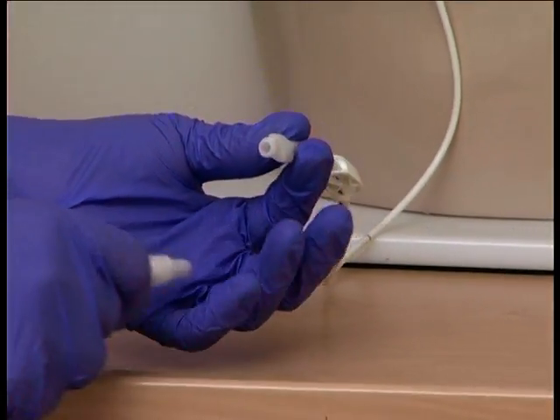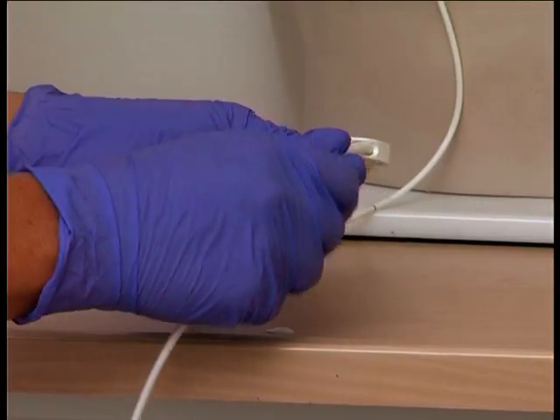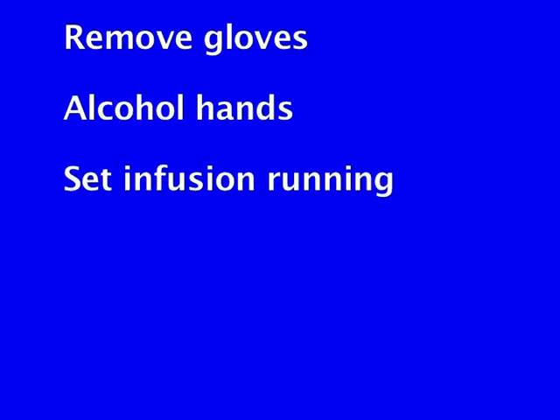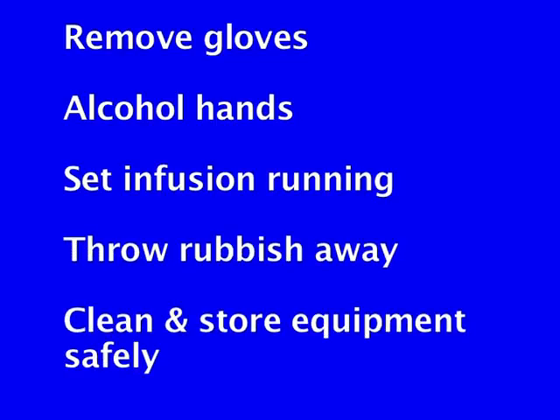Using a two-hand technique, remove the cap from the giving set and attach this securely to the CVC. Remove your gloves, alcohol-gel your hands, set the infusion running, dispose of all rubbish, clean and store equipment safely.